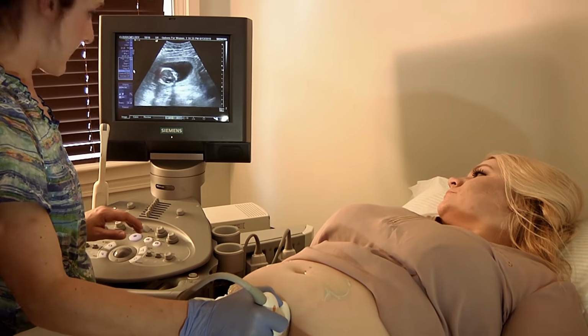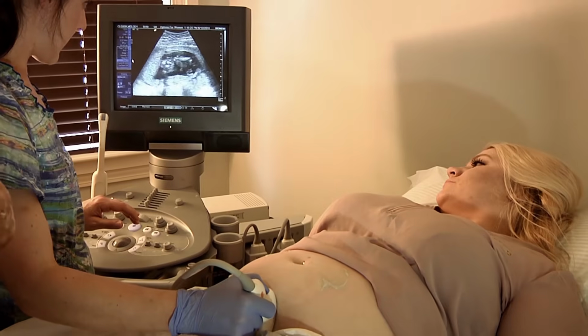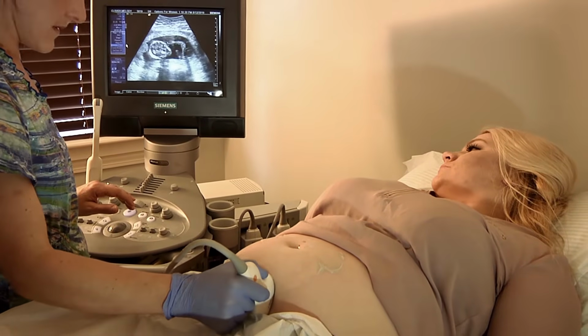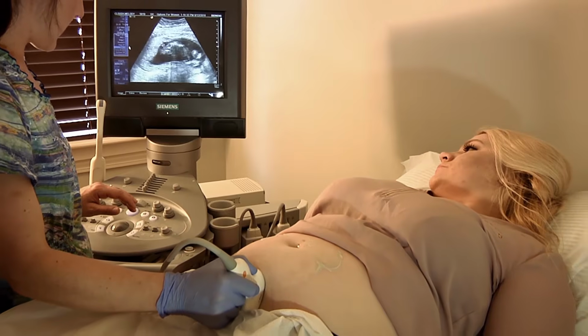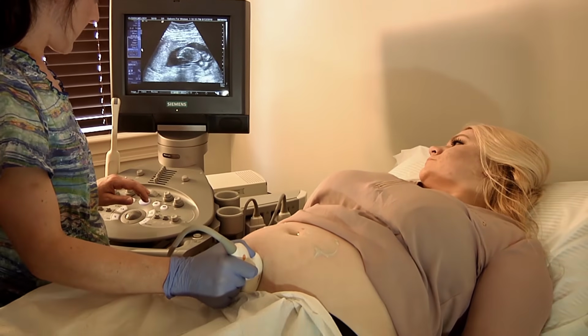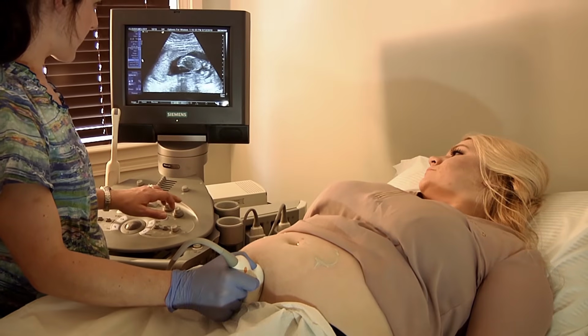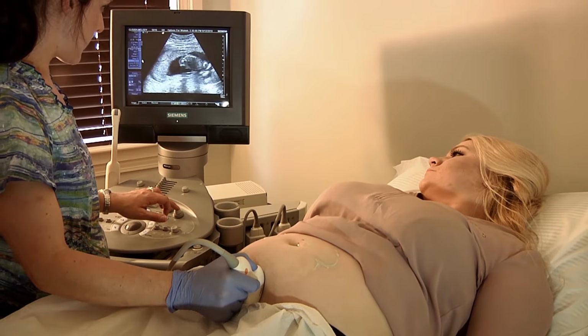Okay, now you're going to travel down the road and you're going to get the heart. Keep coming. There's your heart. Okay, now do you want to get an M mode try or a Doppler? Doppler. Okay. So hit M.